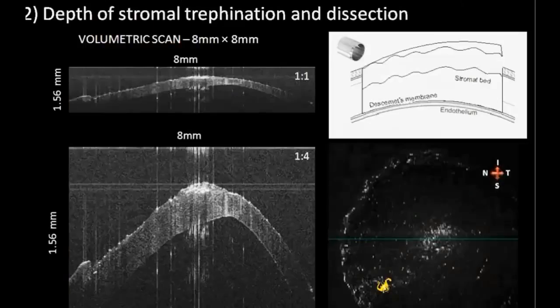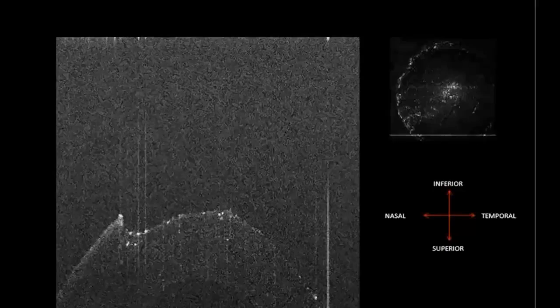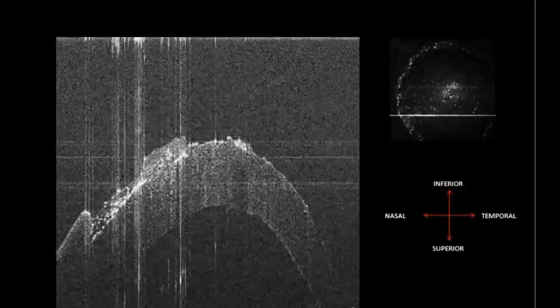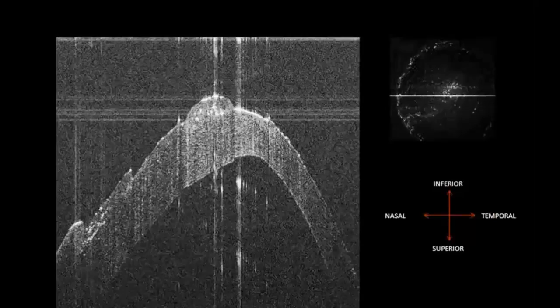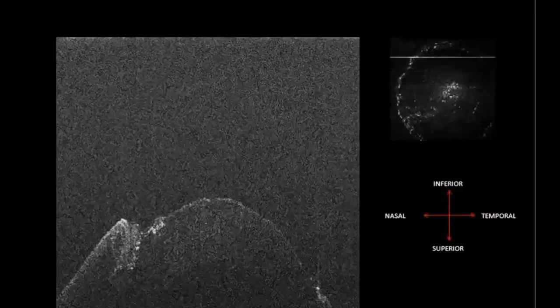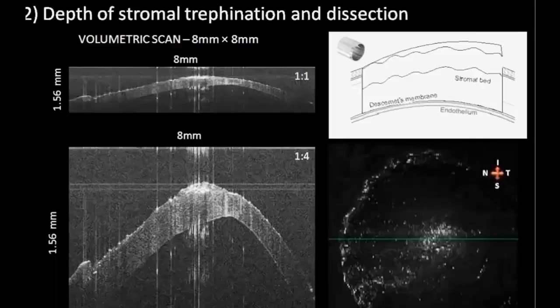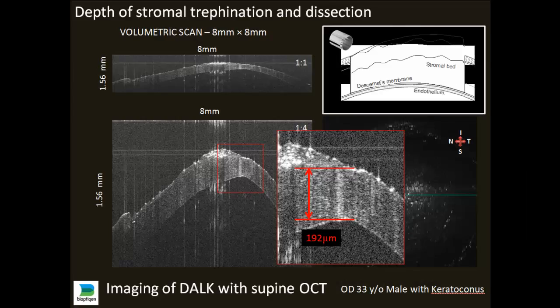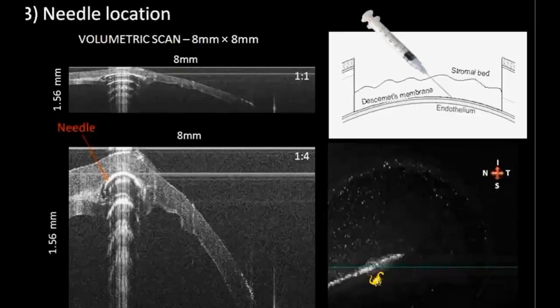In the DALK surgery, we perform partial thickness trepanation. This is after partial thickness trepanation, and here you can see that we still have a fair amount of stroma left behind before we're left with Descemet's membrane and endothelium only. Here we have the scan, and at high magnification I can see I still have 192 microns left before I hit the Descemet's membrane.